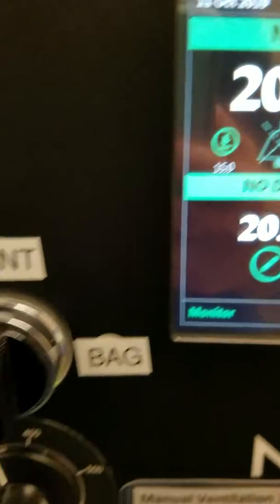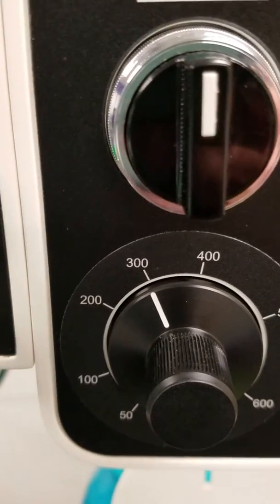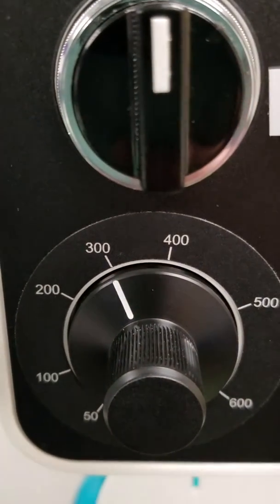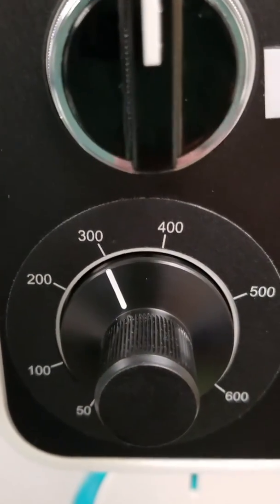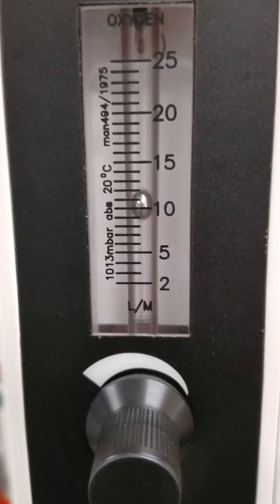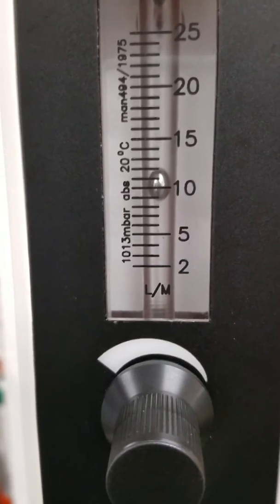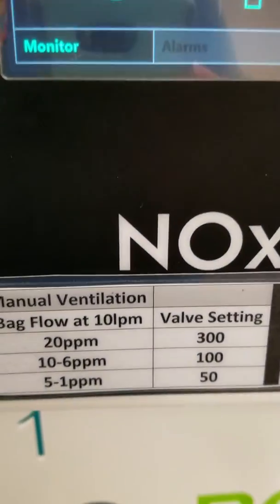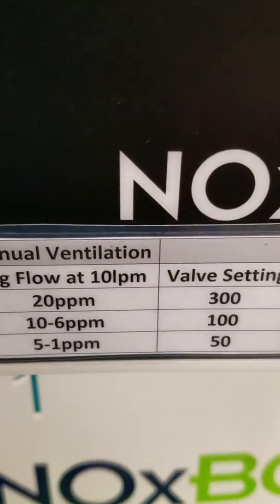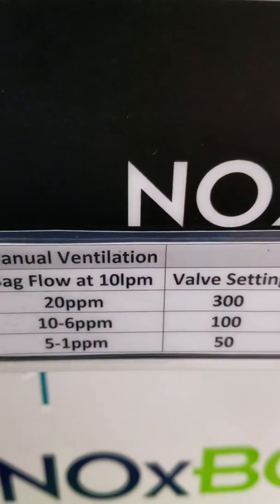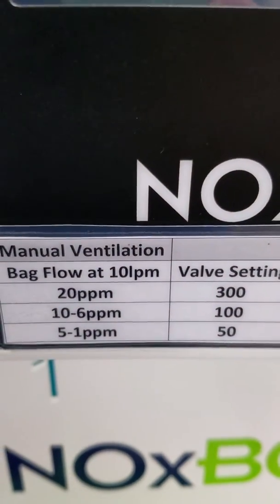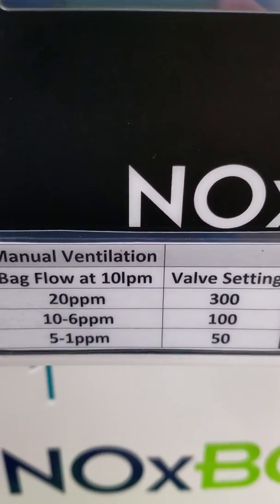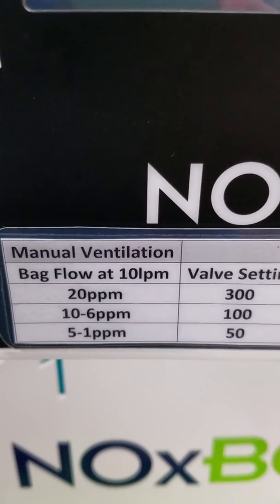Next, I'm going to note the position of my valve, which is currently at 300. My flow meter is set at 10. We're utilizing a chart here at our facility. My bag flow is set at 10 liters. To deliver 20 parts per million, my valve setting will be at 300.